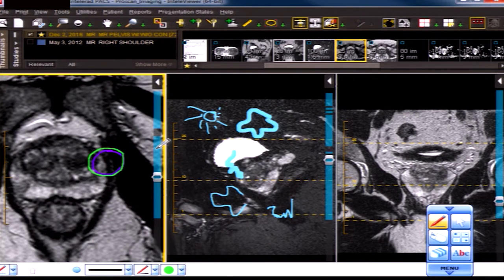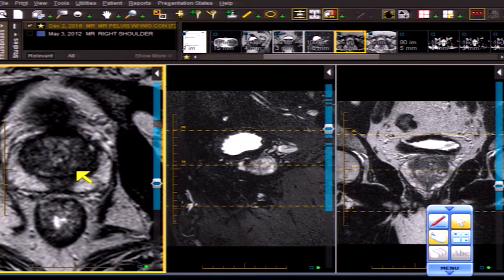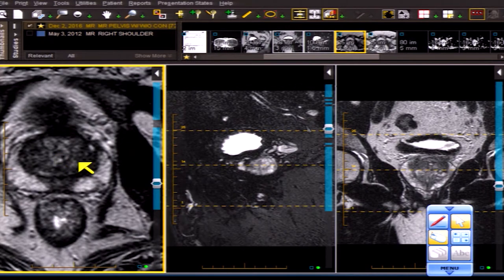Organized chaos is commonly seen in the central zone and transitional zone, with multiple lesions having circumscribed margins. In this case we have a bright lesion with good encapsulation, one that's more lobulated but also encapsulated, and one that's a bit darker. You won't sort these out on T2 alone — you need the diffusion image, ADC map, and DCE MRI. Organized chaos is the rule, not the exception, in the central and transitional zone of the prostate.